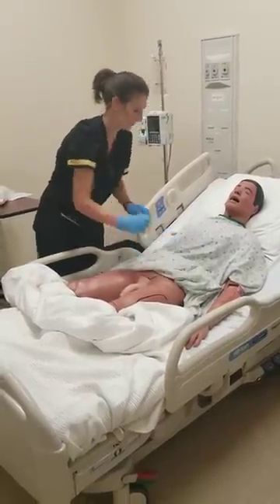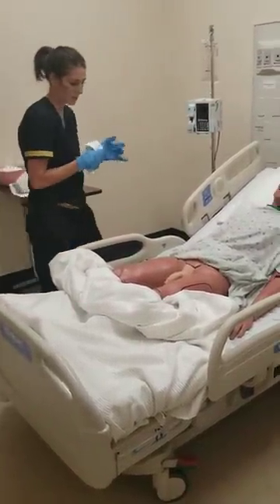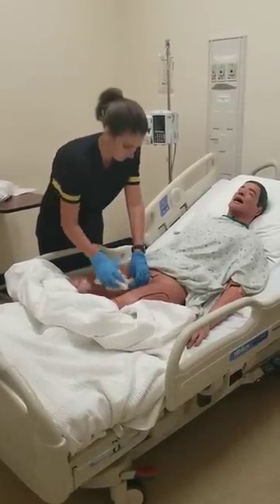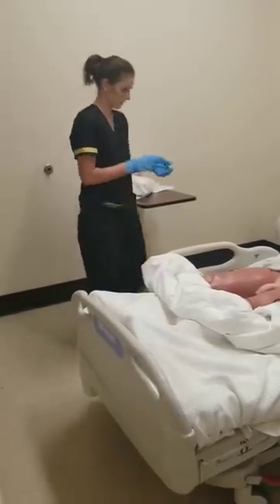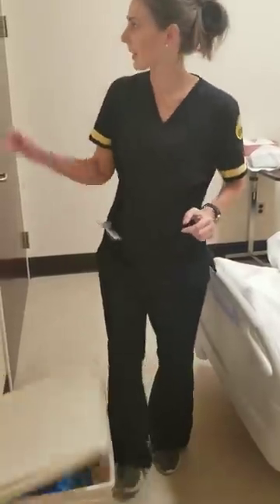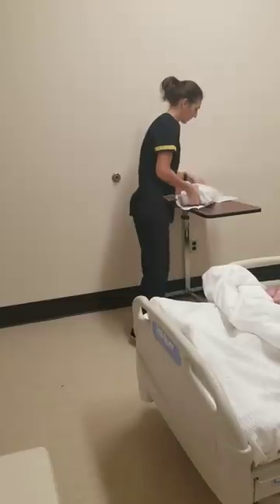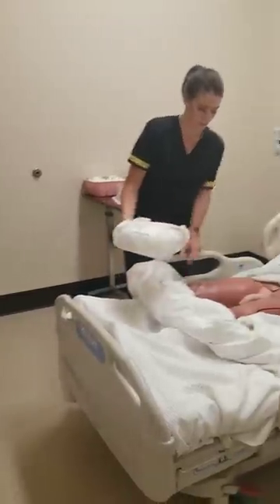There you go. I'm just going to take this cloth, and I've got water and soap on it, and we're just going to clean the area. All right, dispose of that. I'm going to go ahead and rewash my hands, because we're going to have to use sterile gloves for the next part, and that's just to cut down on any kind of contaminants. Do you mind if I set this here? Thank you.